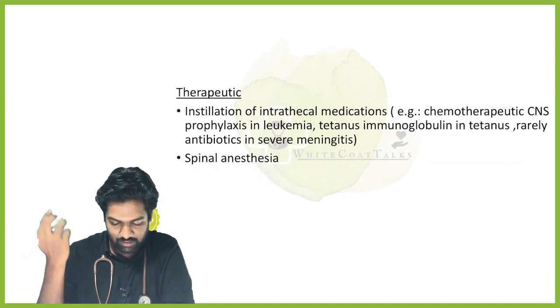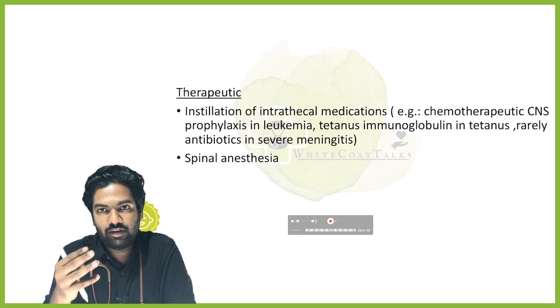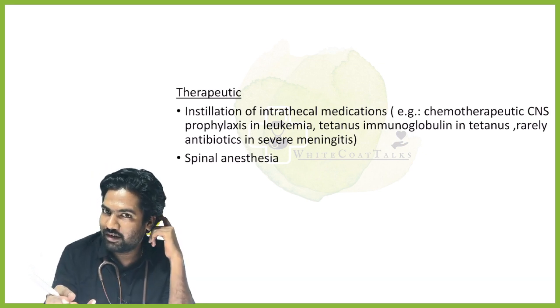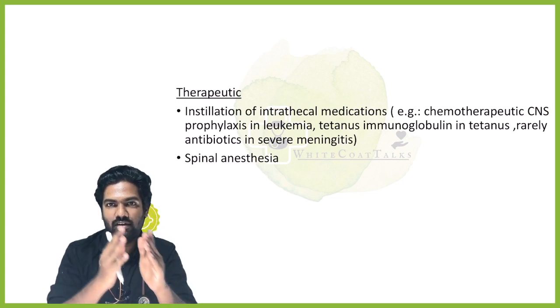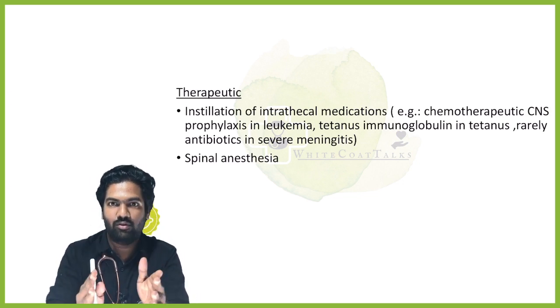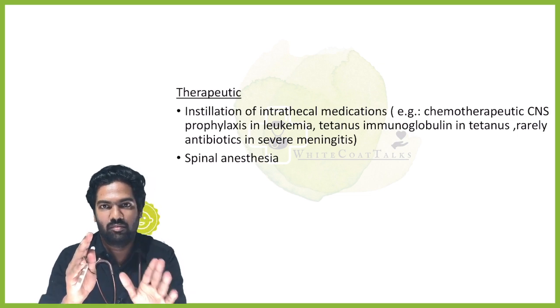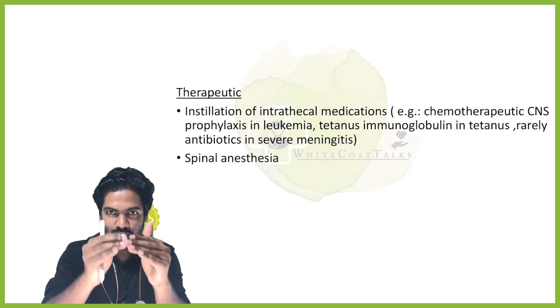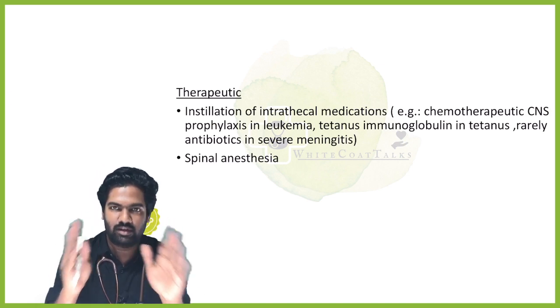Okay, next there are other uses of this thing. Imagine now if an LP needle is being given to you, I want you to answer that. Sir, there are diagnostic indications, there are therapeutic indications. The moment you do that, you are casting an impression on the examiner that this fellow knows stuff. Even if you don't mention Guillain-Barré, no problem. But categorize it as diagnostic and therapeutic.